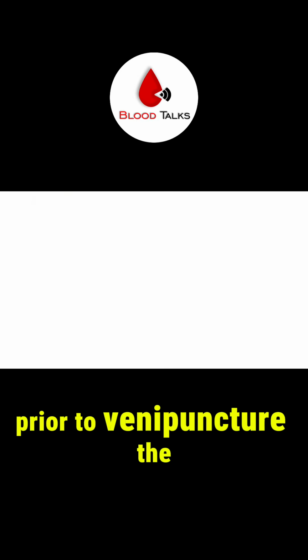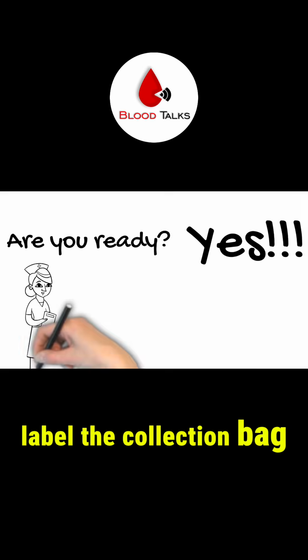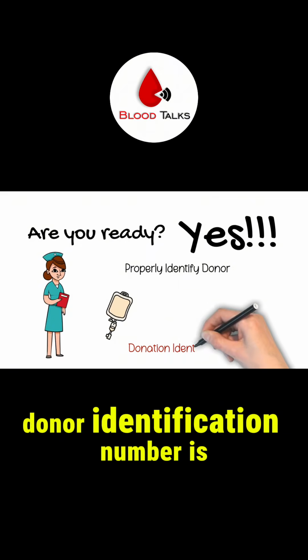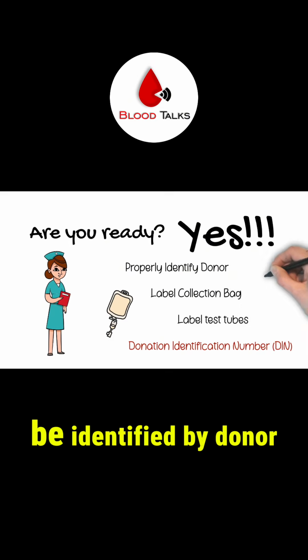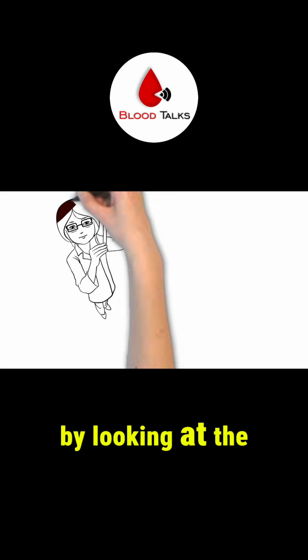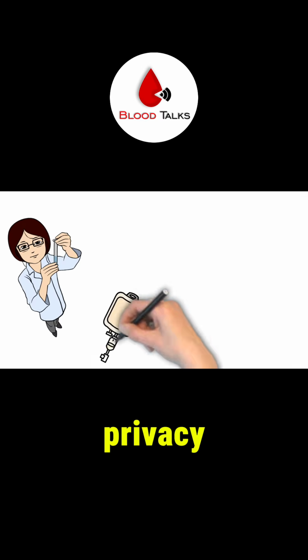Prior to vein puncture, the phlebotomists have to properly identify the donor, and label the collection bag and test tubes with the Donation Identification Number label, or DIN. The donor identification number is really important because from this point on, the donor will only be identified by donor number. Laboratory personnel will not immediately know who the donor is by looking at the test tube or the donor bags. This is to help protect donor identification and privacy.